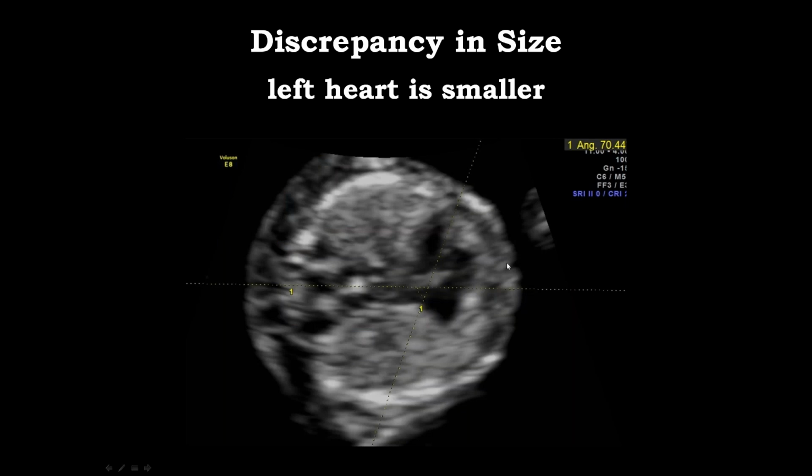What we learned from the cardiac axis study, and this is what we are doing on every single patient now in our clinic when we perform the scan between 11 and 14 weeks of gestation, is that by taking the measurement of the cardiac axis, we can also look at the proportion of the cardiac chambers. And this is a good example showing that the right side of the heart looks bigger than the left side, and that the cardiac axis here is definitely abnormal. And the reason why it's abnormal, most likely, is this discrepancy.